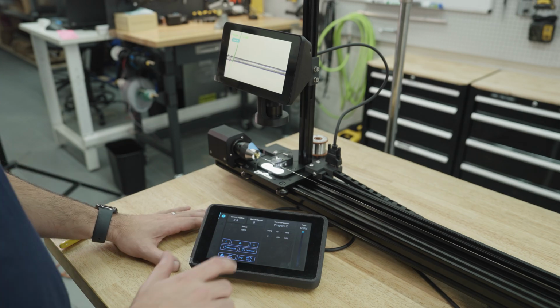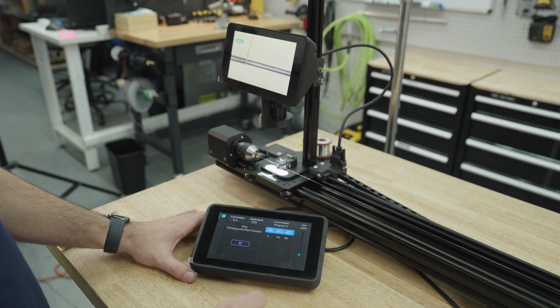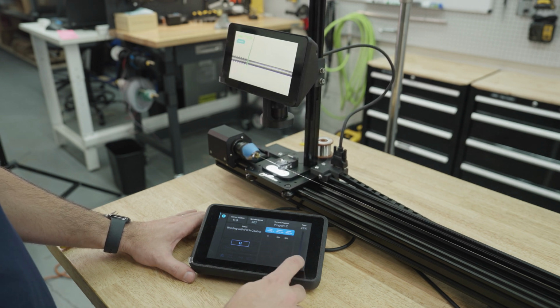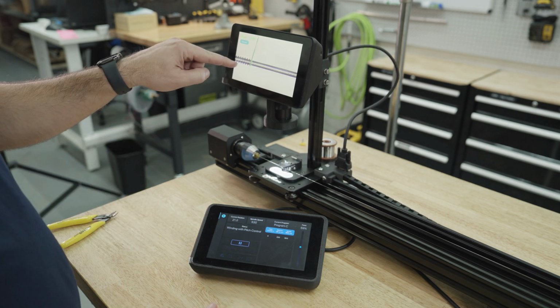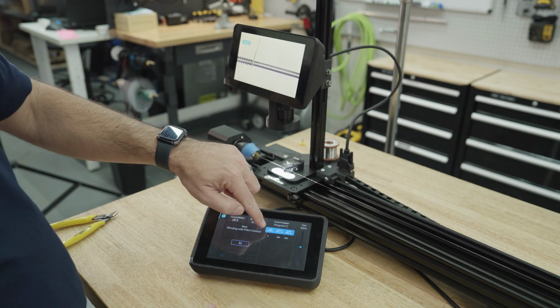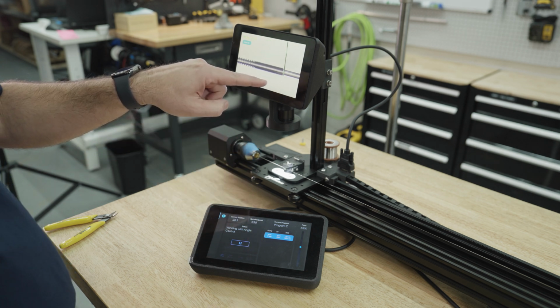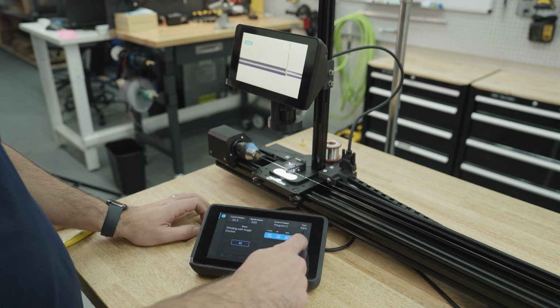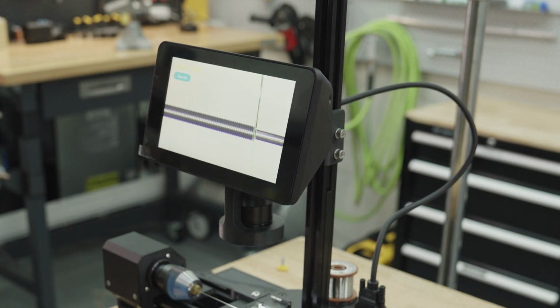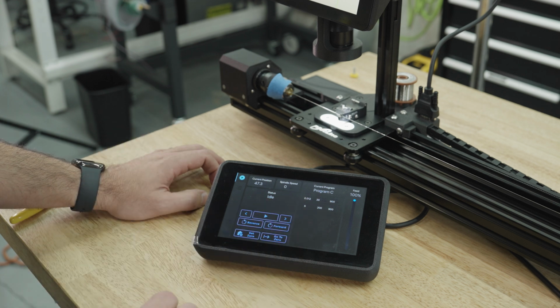To start a program, just press play. You can change the feed rate in real time right here. And in this segment, you can see we're making an open pitch move, which is exactly what we programmed here. Now we've transitioned to closed pitch, and the machine is targeting an angle of 5 degrees, regardless of pitch. After the specified number of turns are completed, the machine stops.